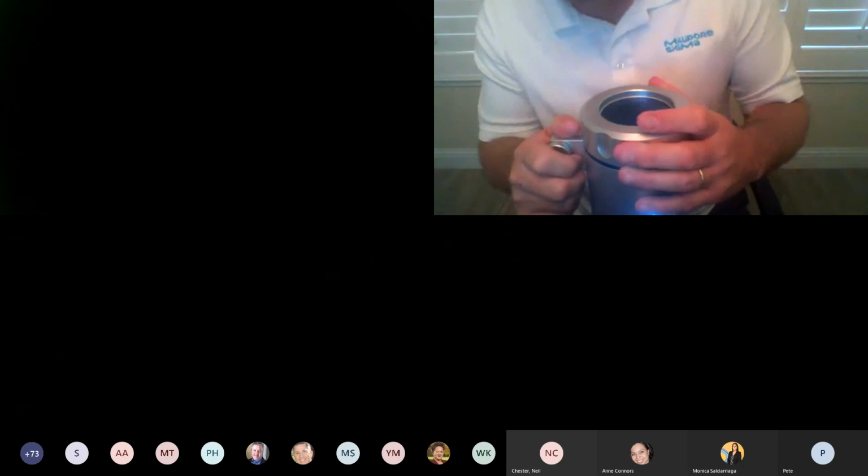Are there any more questions? There are no more questions in the box. Does anyone want to ask live? Okay. Let's see. Yeah, thank you, Amber.